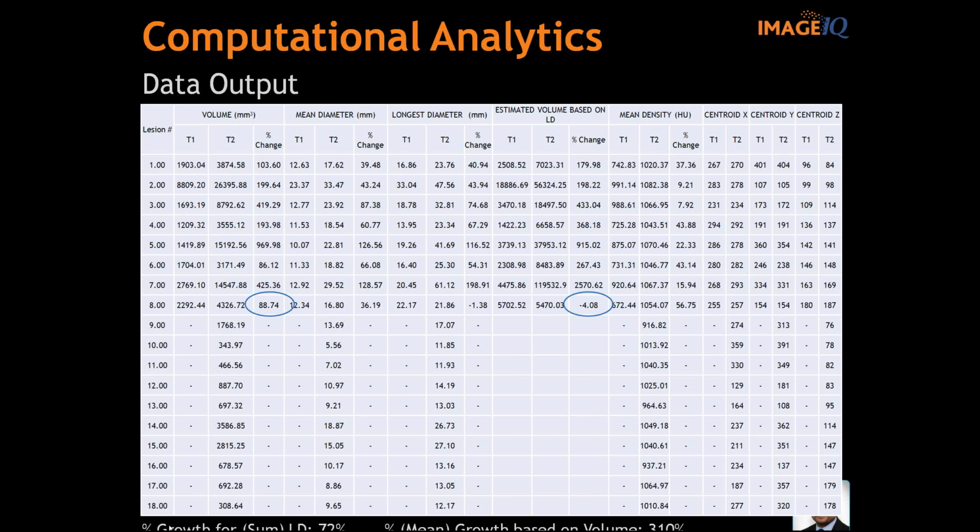And you can categorize disease better than you did before, and I understand it becomes more of an exercise in research and development, but at least it opens up new ways of thinking about disease, right? Right. You can define it up front and use the data directly in your trial, or you can say, you know what, I want that data just in case at the end we really need to do some additional research on this, and perhaps the RECIST is unimpressive to the FDA, but you say, look at this volume change. It's a 50% change in volume. So it gives you opportunities that you wouldn't otherwise have.